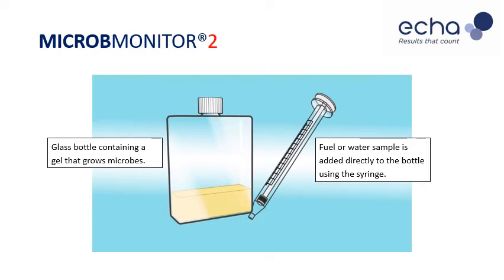Before starting the test procedure, remove and discard the plastic seal on the cap of the Microbe Monitor 2 test bottle. It also helps to loosen the cap of the bottle ready for the test.